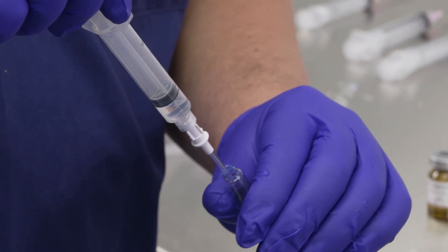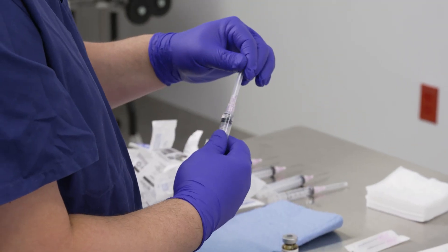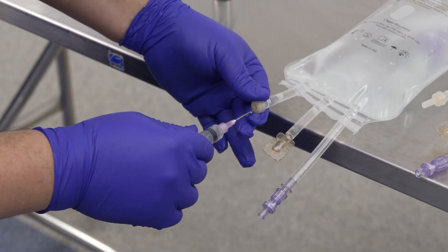When drawing alprostadil from an ampoule, a filter needle or straw must be used. Inject two milliliters of alprostadil into the vasosol.